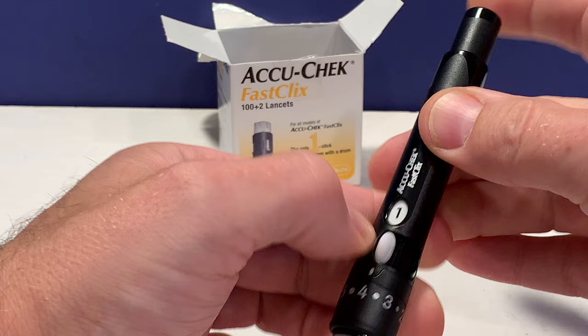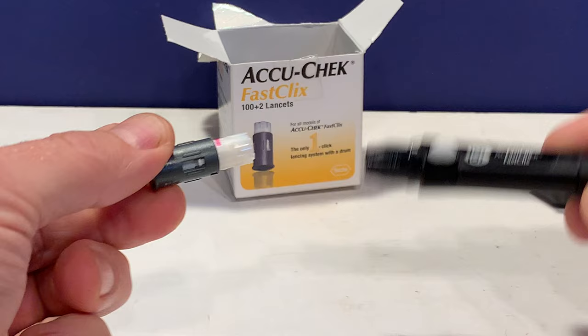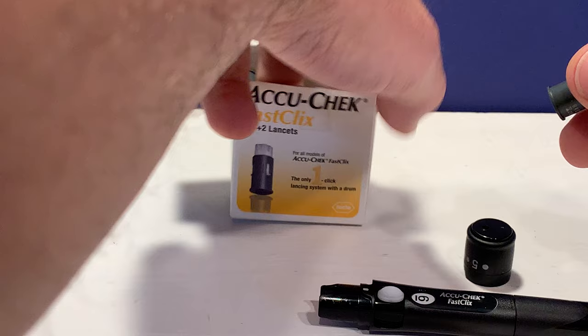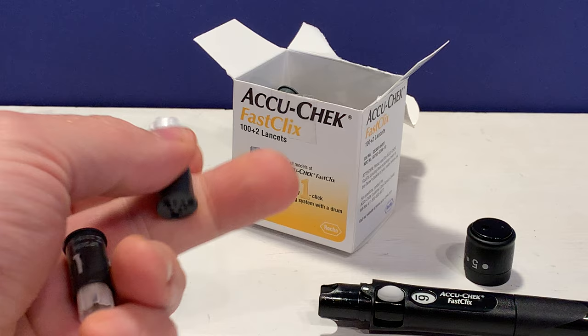Okay, so if we do that then we're done — it won't let us advance to the next one. So all you need to do is just remove the end and then you pull out the drum. Now it's easy to determine which drums you've used already. As you can see, once they're used it pops out and that little pink stripe is visible, so it's easy to tell.